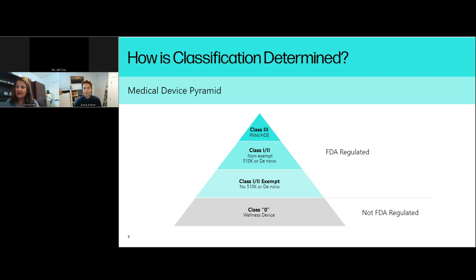We saw that when PEEK, polyether ether ketone, became a material. I mean, heck, when I started designing medical implants over 30 years ago, your choices of materials were stainless steel, cobalt chrome, titanium was the new hot thing, and I'm dating myself, and ultra high molecular weight polyethylene. So when PEEK came out, we did a heck of a lot more testing on a PEEK implant for the FDA and for regulatory agencies to get a comfort level around it, and those requirements have tapered down. This will eventually happen with the FDA, but because it's got to keep coinciding with the new technologies that are coming out.